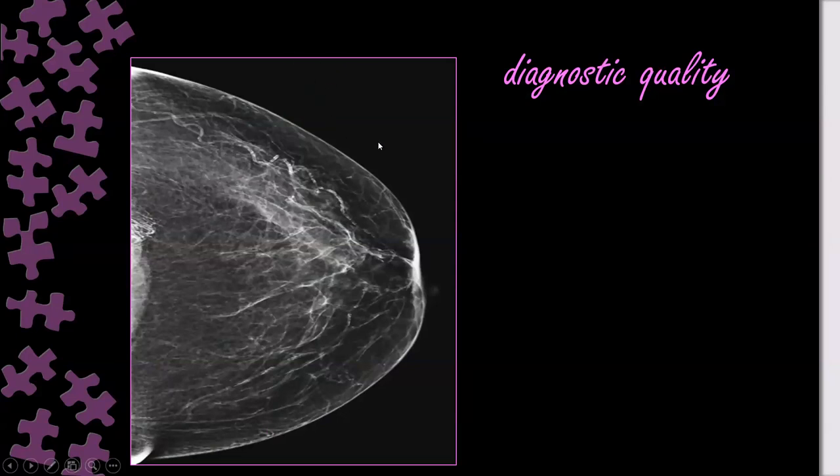Artifact. There is excellent. Artifact. Where is the artifact? The posterior fat over exposed at the pectoral muscle. Pectoral muscle, overlying the pectoralis. What about that artifact?